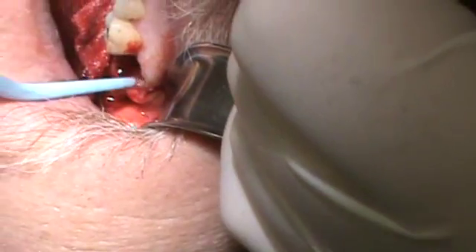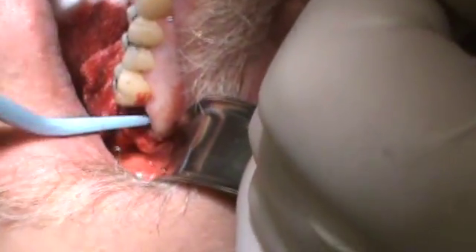Sometimes maxillary molars roll out easily. He's got good bleeding, which is good. Hopefully he won't have a dry socket — I'm always worried about that, but usually you don't get that in the upper jaw.